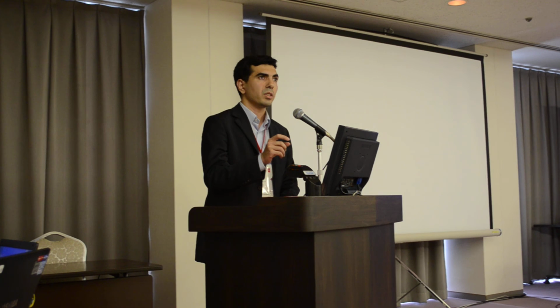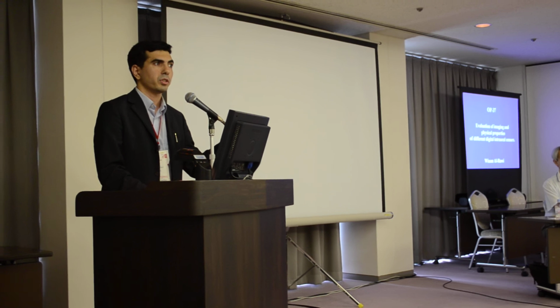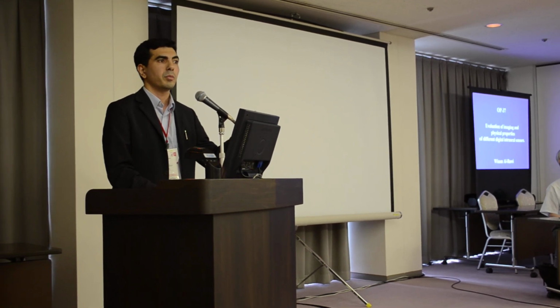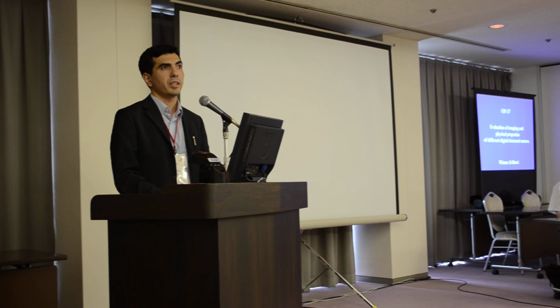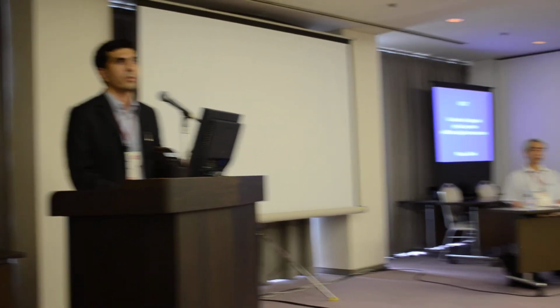Well, when we initially started testing the Planmeca sensor and the Schick sensor, the company told us the exposure time, and we were using 0.2 seconds for anterior teeth. When we switched to digital, the same X-ray machine has digital settings, and we went from 0.2 to 0.05, which is basically about a 75% reduction in exposure time. When we went to 0.2, the sensor was so saturated we did not get any image at all. And for almost all the sensors, we were around 0.05 to 0.064.